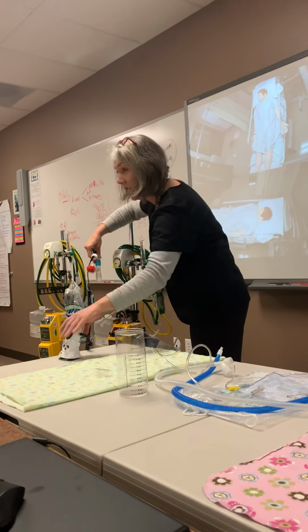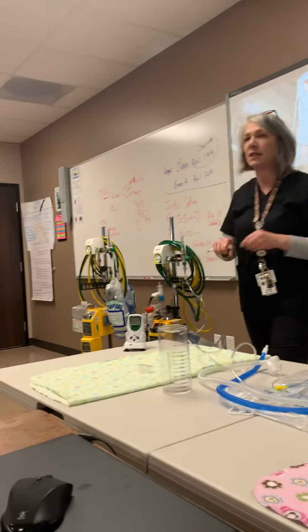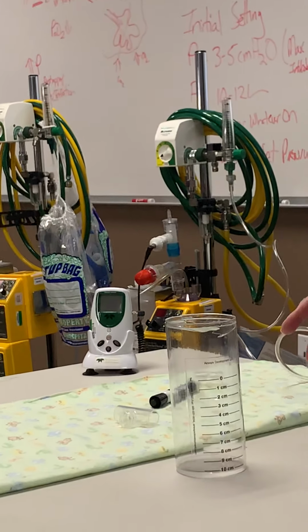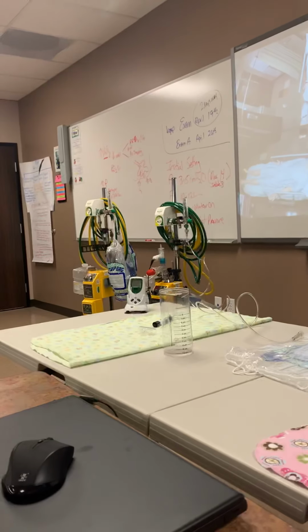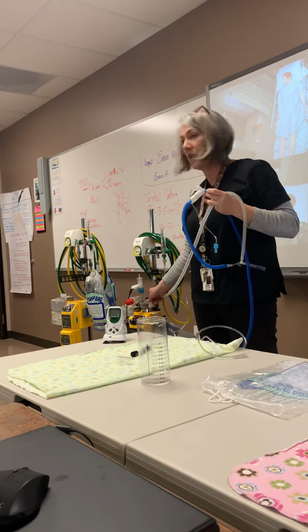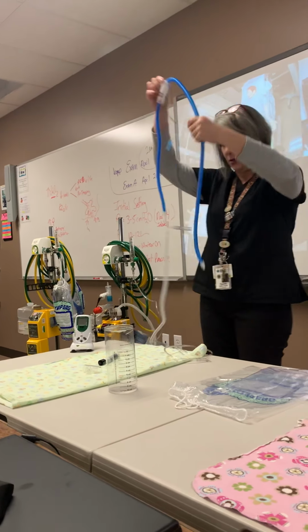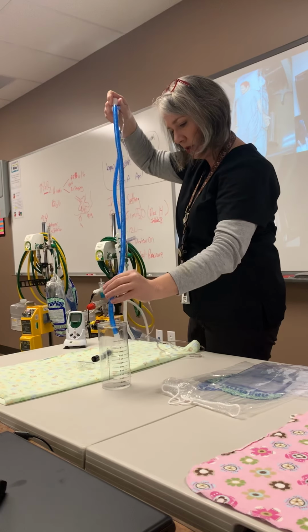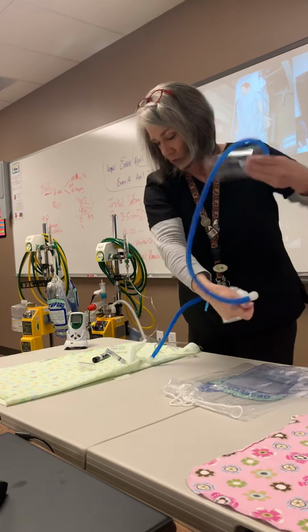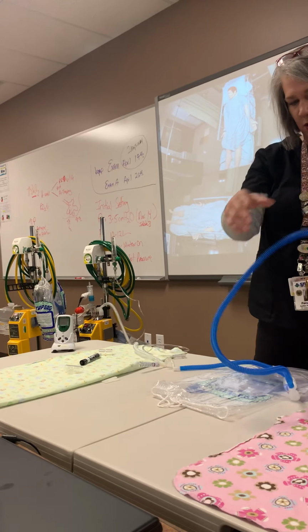It doesn't matter what side, because CPAP stands for continuous. I don't have an inspiratory or expiratory side. Same with your line, your circuit. I don't have an inspiratory and expiratory, so it does not matter what side I put on the other side of the concha. Okay? And then this goes in my water adapter down to my level. Then there's my system. This is all kinked up.